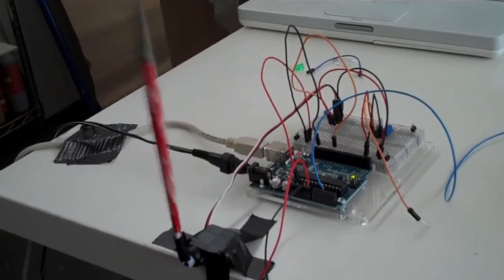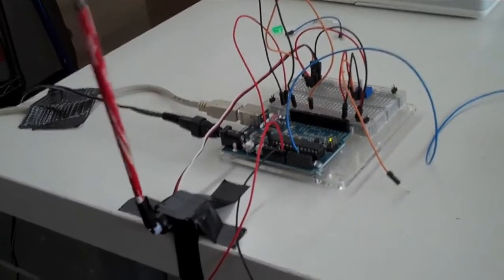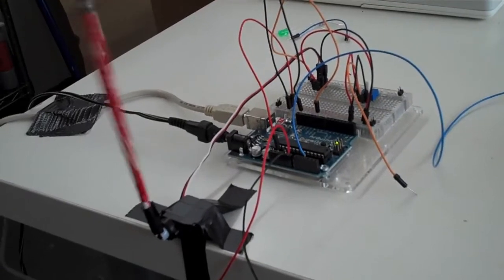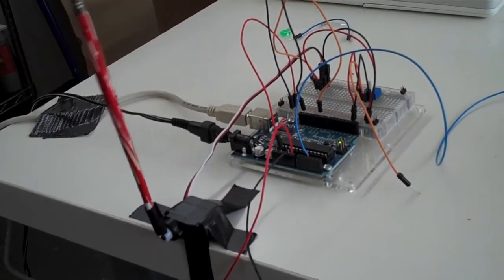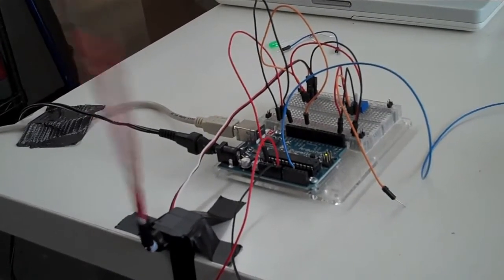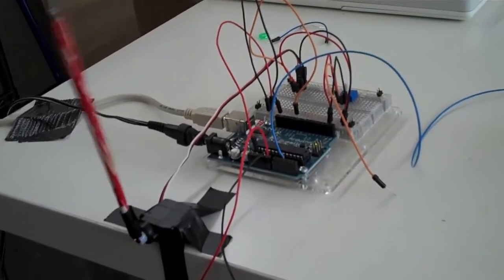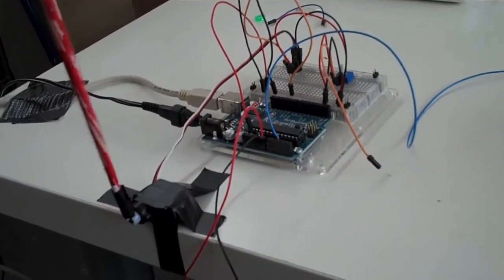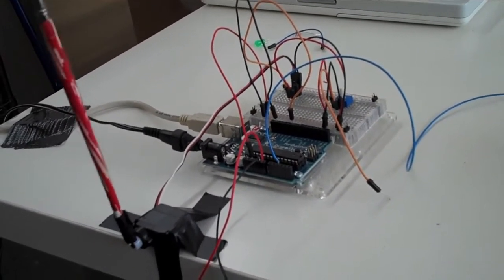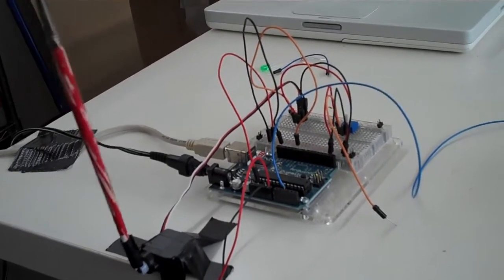The twitchiness you can see is because I'm not using the full range. Basically the 0 to 5 volts is split into 1024 bits. The range I'm using is about 2 volts, and then I'm amplifying my signal in the software times 4 to get across the 1024 range. So any noise is being amplified by a factor of 4. By choosing the correct gain on the op amp, we get that 0 to 5 volts range in hardware, which will significantly decrease noise by a factor of 4, and then any extra smoothing can be done in software to prevent this twitching.